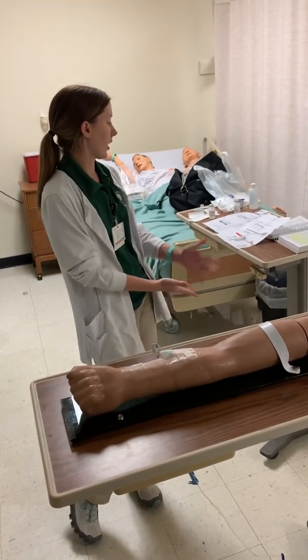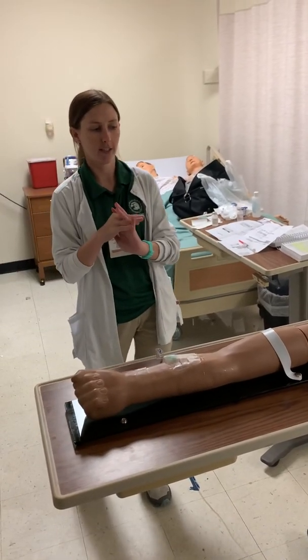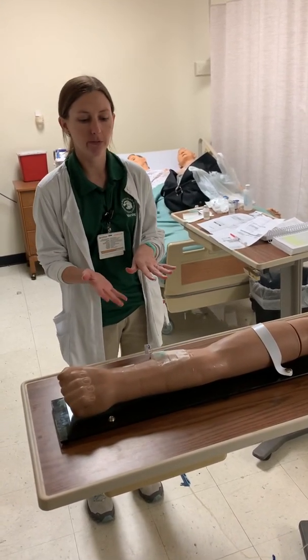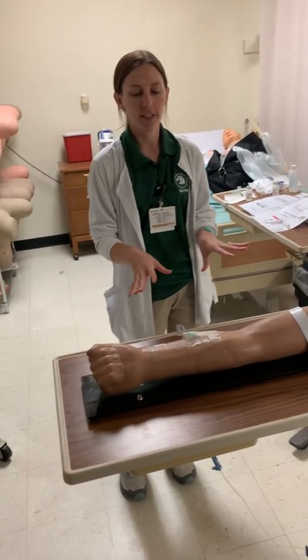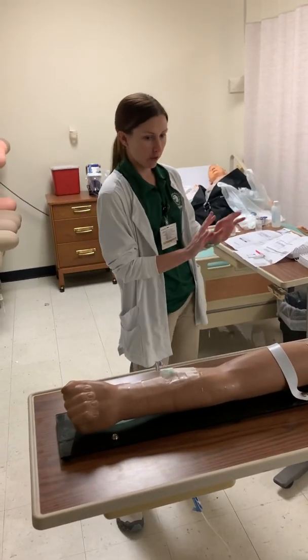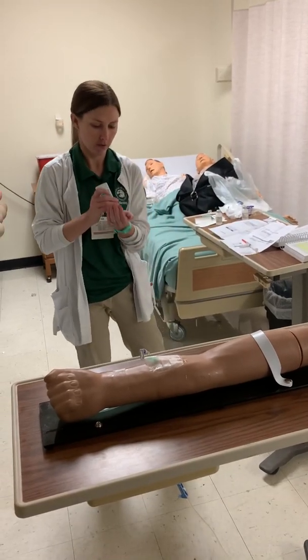I want to explain that the doctor has ordered digoxin to be given IV push, but this is not going to involve any additional needle sticks. That I am going to be administering this medication over 5 minutes, so I'll be in here with them for 5 minutes, and I'll be monitoring them the whole time. It'll go through their IV, so make sure they understand the procedure. And then I want to wash my hands before touching the patient, so I'm going to pick up hand wash.